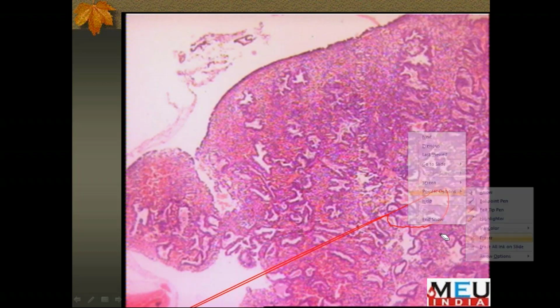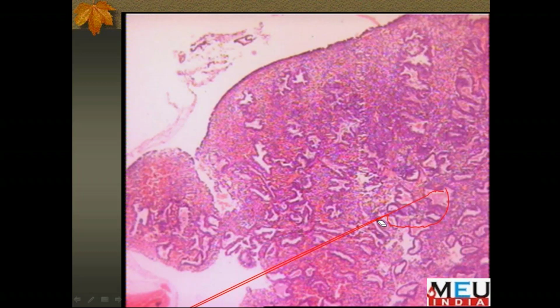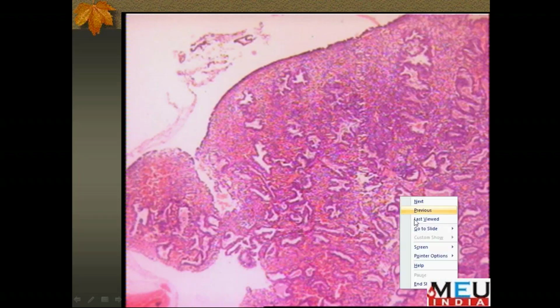A small cuff of tissue starts appearing, which is called pre-decidualization. Gradually, this periarterial cuff becomes so big that it starts pressing the blood vessels, and it sort of prepares the blood vessels to be shed.